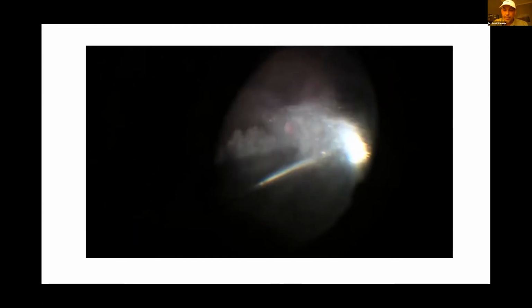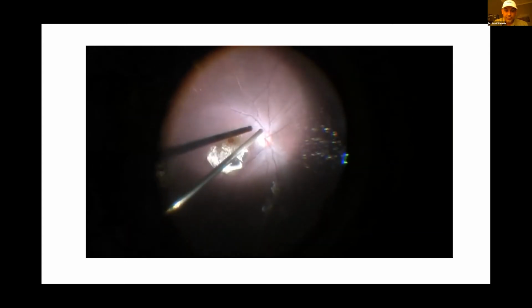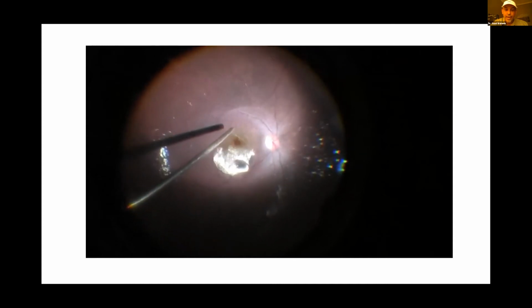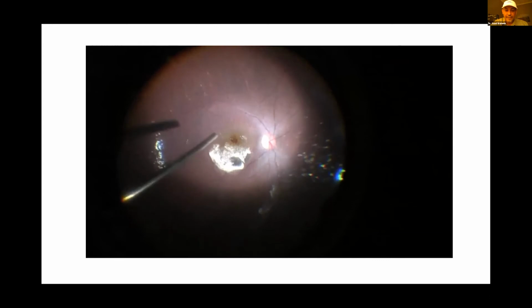I went in to try to induce a PVD, which was not easy. You have to try a couple of times, and I always teach the fellows with me that you get closer to the edge of the disc, and then you apply vacuum until you feel that you have a good grasp. Once you have a good grasp, then you pull to the top and tangentially. As you're seeing here, I'm trying to catch the edge of the vitreous, and you can see the wave spreading, which is very classic in these cases.